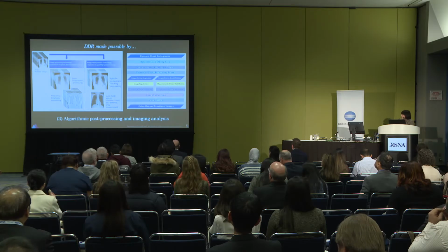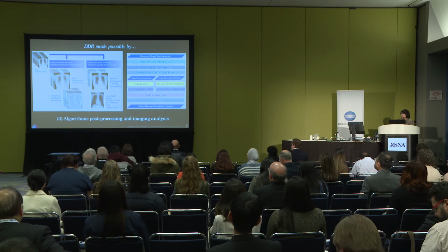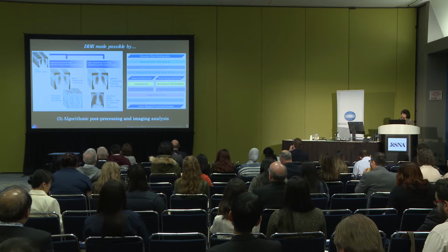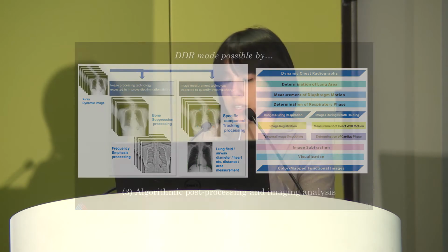And you can also then take the second part of that image, you can do tracking, you can do specific components for the diaphragms. You can then measure the diameters and the distances between different structures and quantify disease in a very different way. This is very exciting because this is a radiograph, which is pretty much a first-line tool that we use in a lot of medical diagnoses.